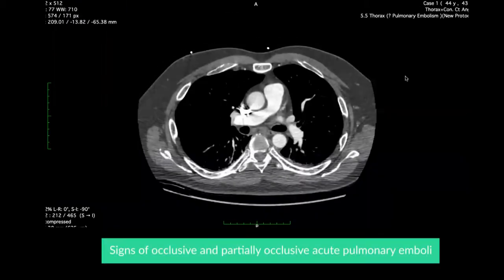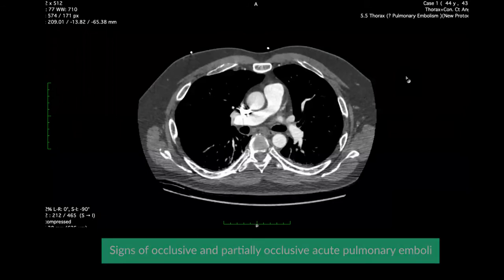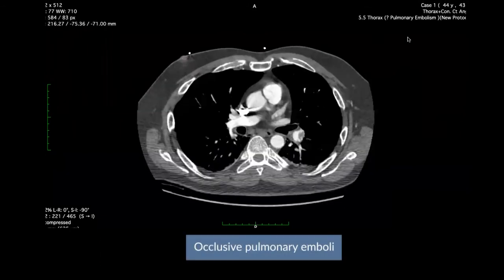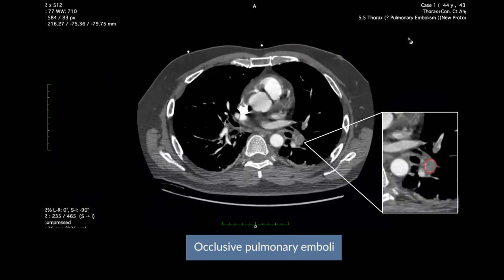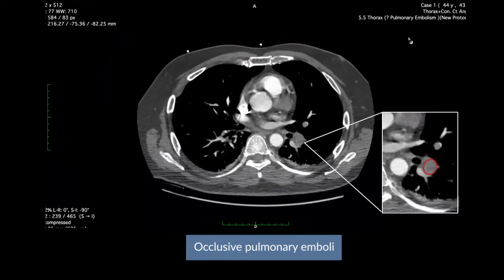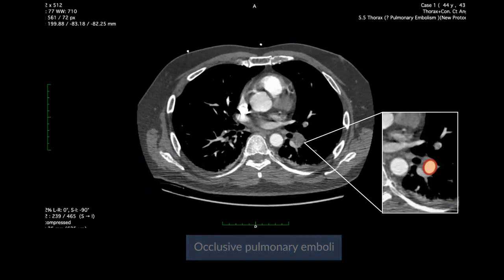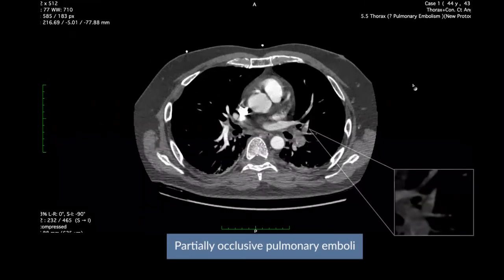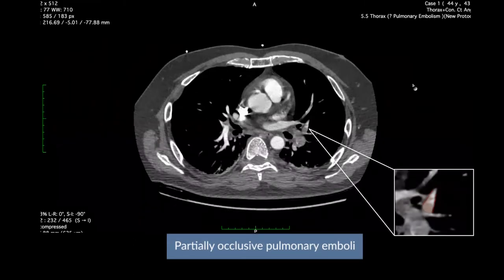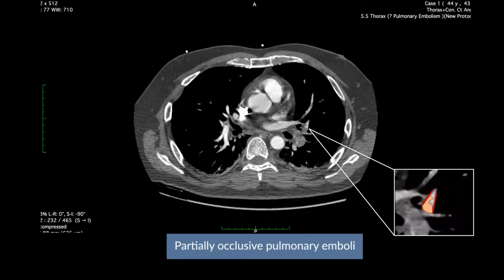This case illustrates the signs and examples of both occlusive and partially occlusive pulmonary emboli. There is occlusive pulmonary embolism within this segmental branch to the posterior basal segment of the left lower lobe. Notice how the entire branch is not enhanced and the artery is enlarged compared to the adjacent vessels. A partially occlusive thrombus can often be seen peripherally against the vessel wall, forming a sharp angle with the arterial wall.